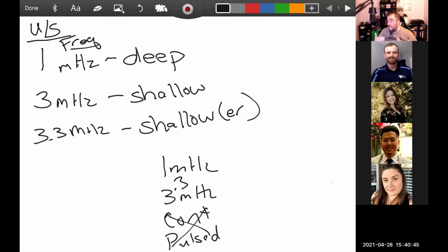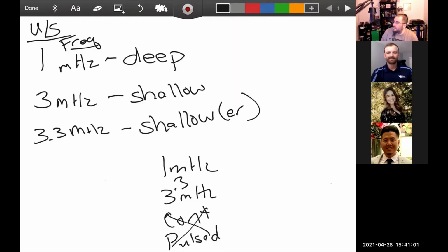Like I've had patients that love ultrasound of the low back or the calves or the hamstrings. And then you do something like their hand and they're freaking out. It feels weird to them. So yeah, you could theoretically, especially when I've worked in a clinic and driven medication, I've definitely used 1 megahertz, but not very often. Maybe if I'm putting some medication here in the thenar eminence.